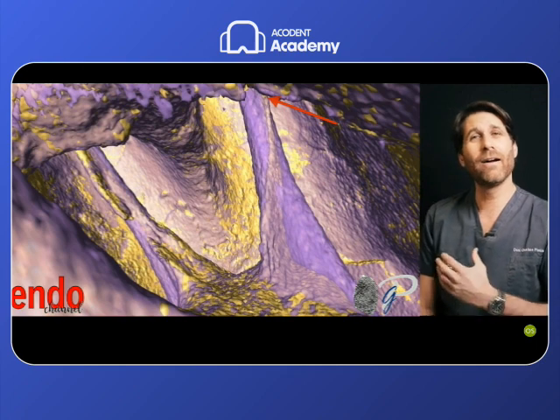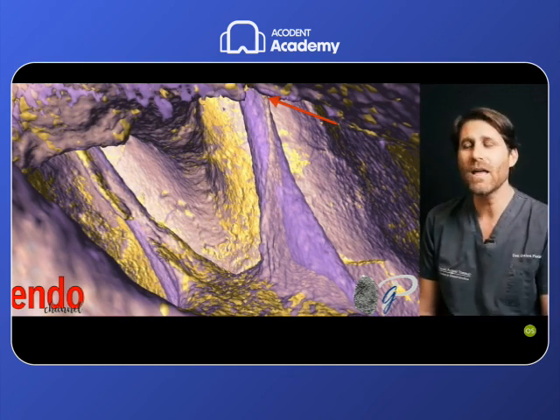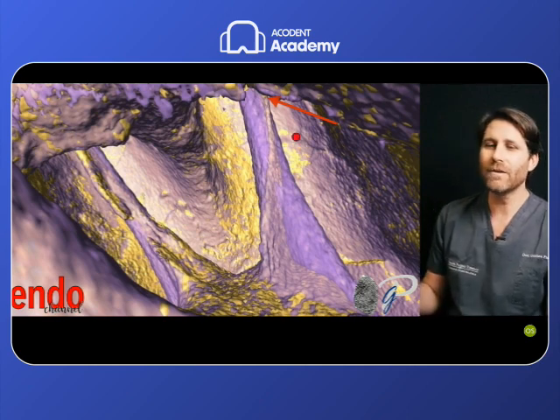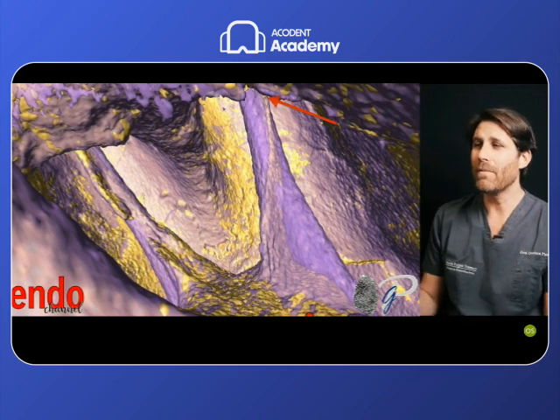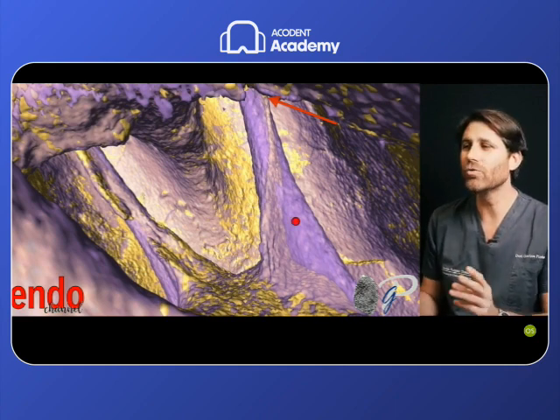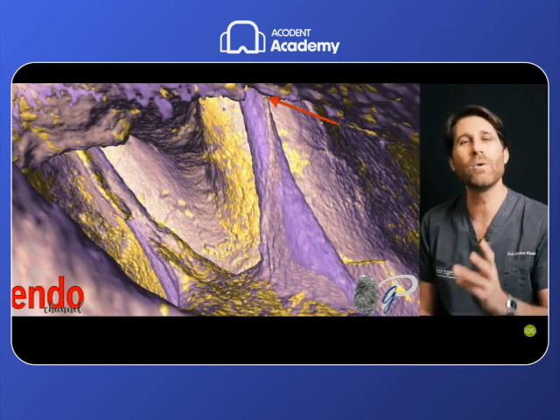These are the several cases that we find in clinical practice in which it is difficult to scout this portion of the root canal by manual file, because the manual file is able to scout 2-3 millimeters coronally of this MB2 root canal, and then we stop and we cannot advance.